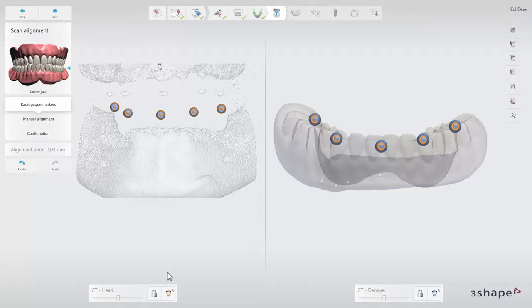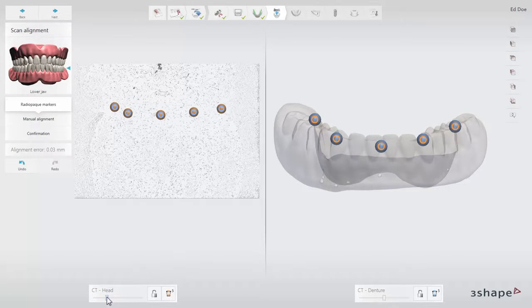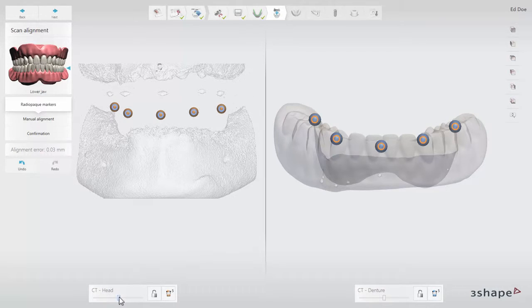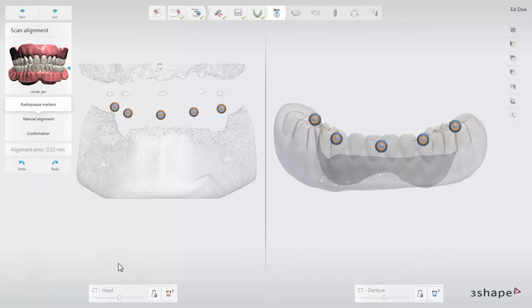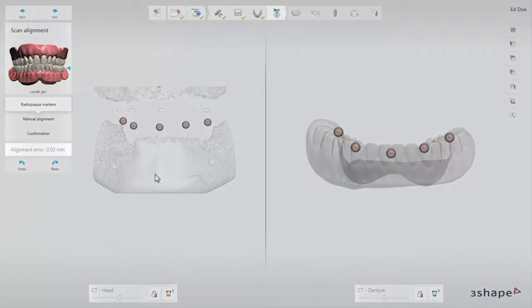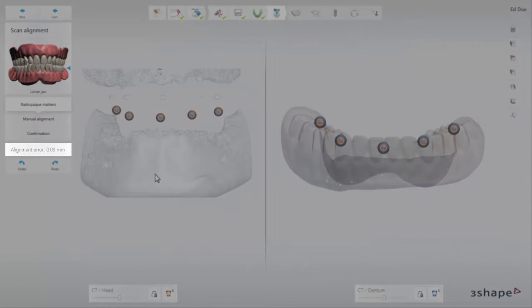Use the threshold slider under each scan to adjust the CT visibility. Click the bin icon to clear all the markers. To lock the scans and move them simultaneously, click the lock icon. The alignment error will be calculated automatically.